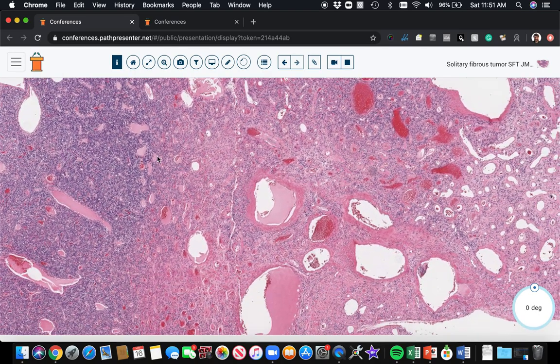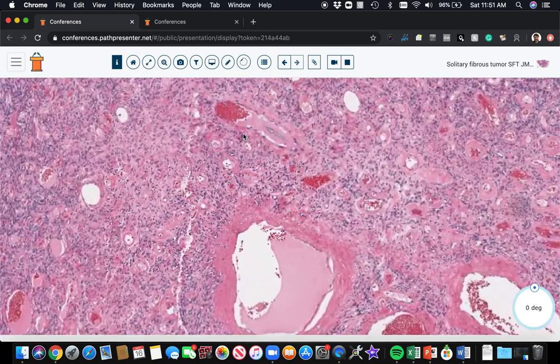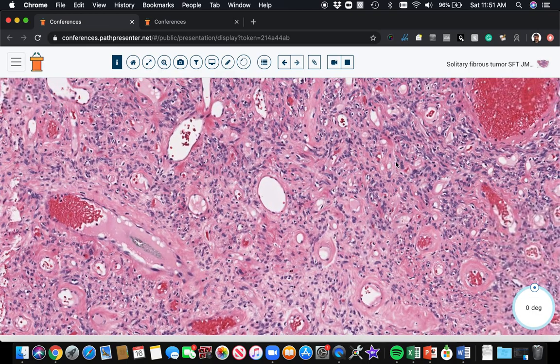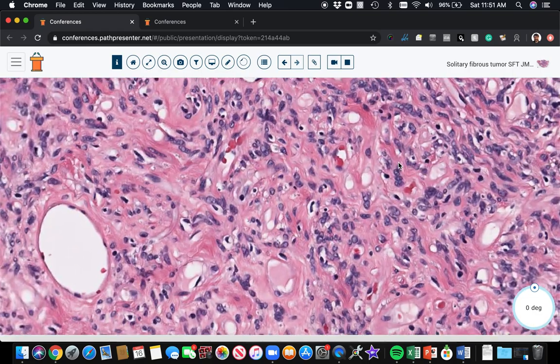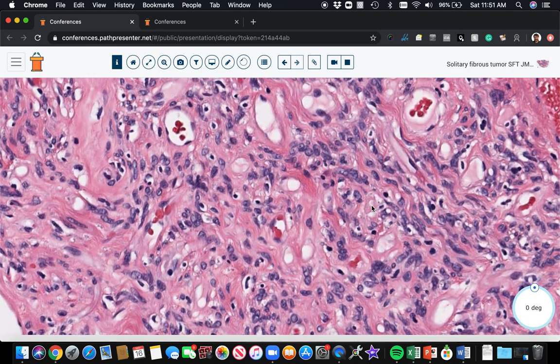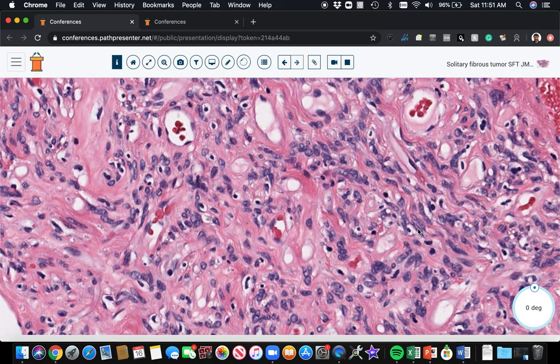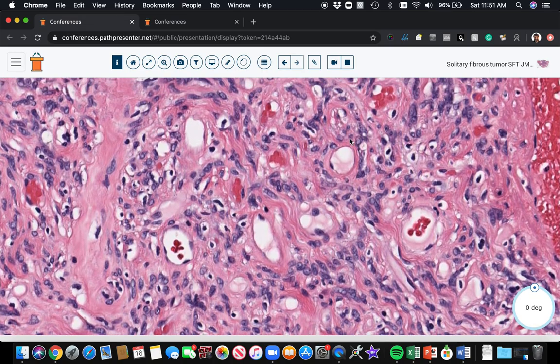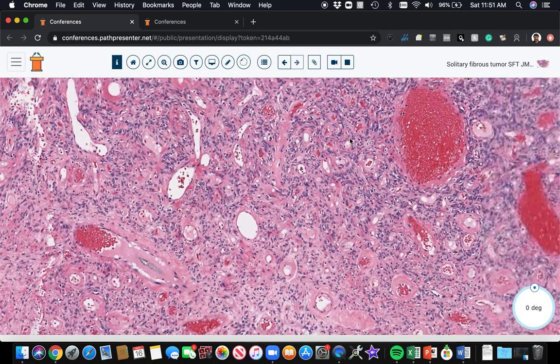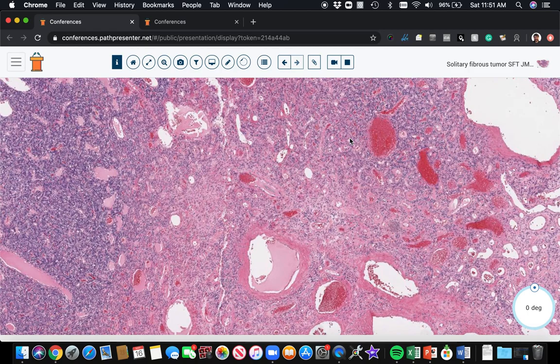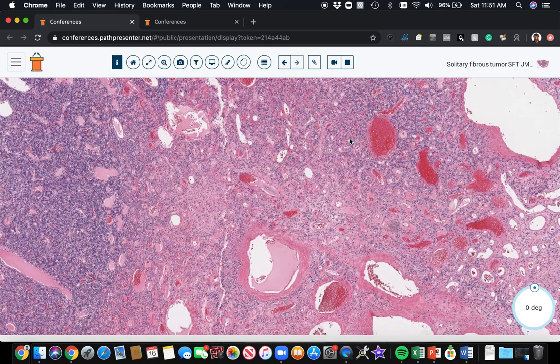So the cells, let's go closer. The cells of solitary fibrous tumor are usually these bland oval to spindle shape, kind of plump spindle cells or oval nuclei. And they often have abundant collagen in between them. Sometimes you get these like ropey collagen bundles in the backgrounds.